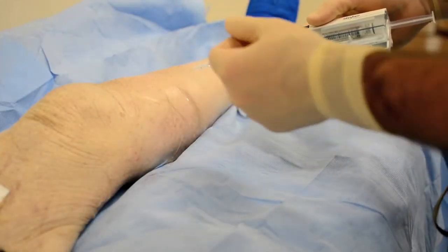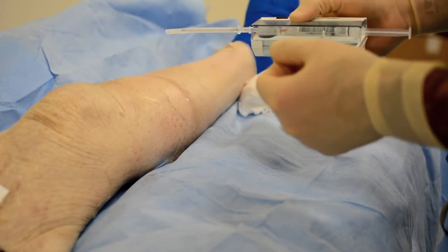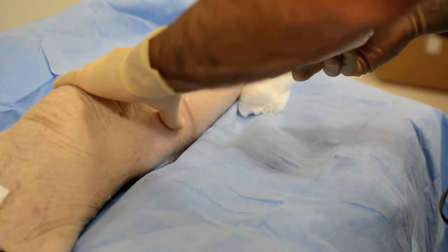You would prep the skin and then determine your dominant hand, which you will use non-sterility to control the device, and your non-dominant hand, which you will maintain sterility in order to palpate the compartment prior to your insertion.